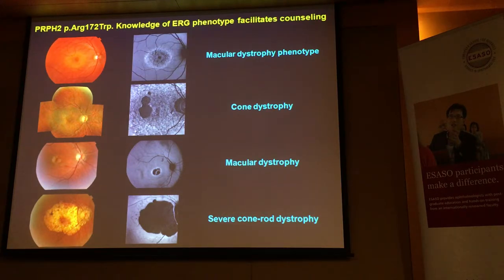So the electrophysiology helps you. And one of the things which isn't shown here, and you can't tell by looking, and you wouldn't begin to guess, is that this and this is a mother and son pair. Go figure.